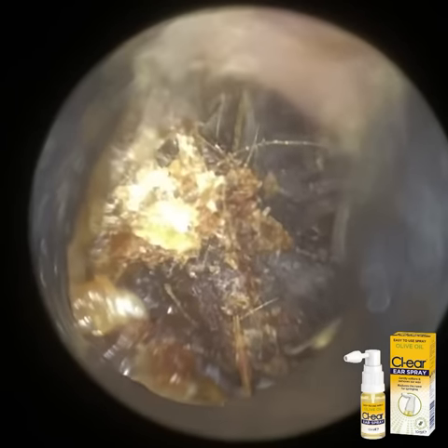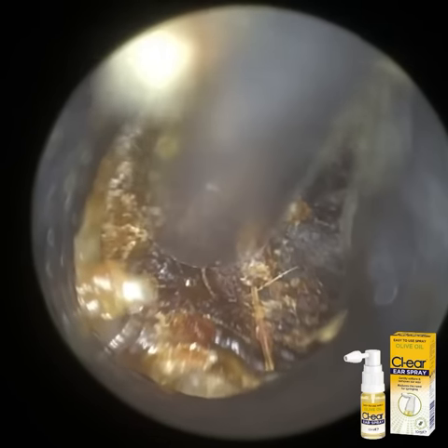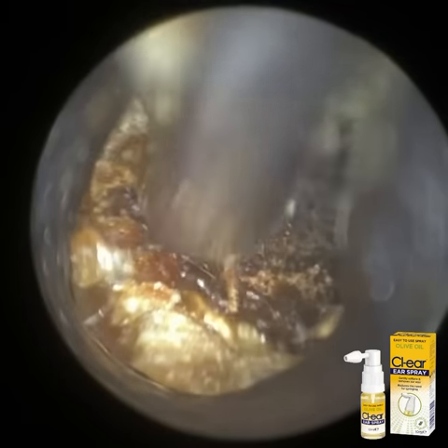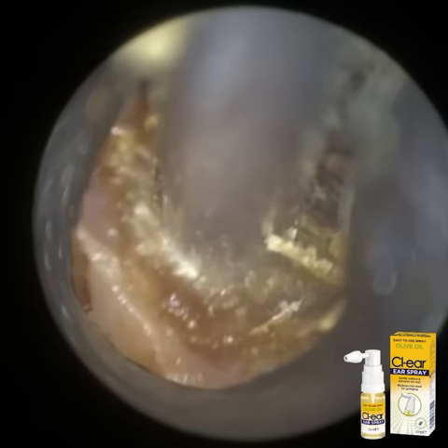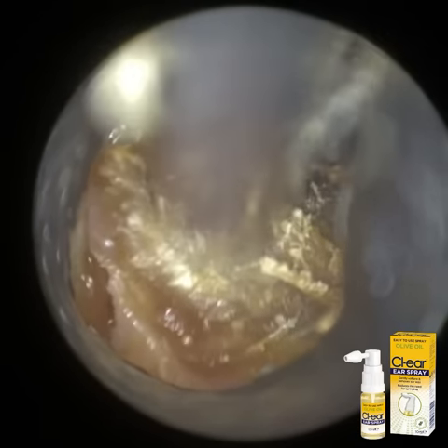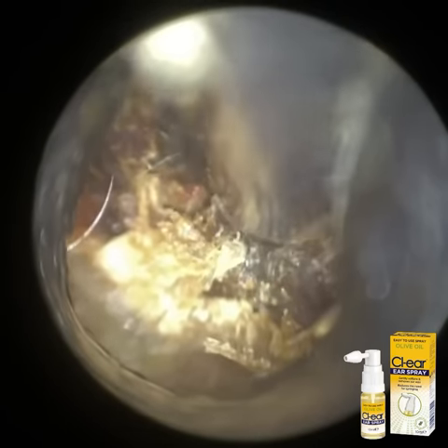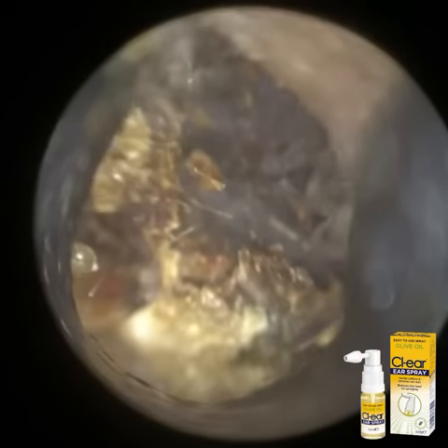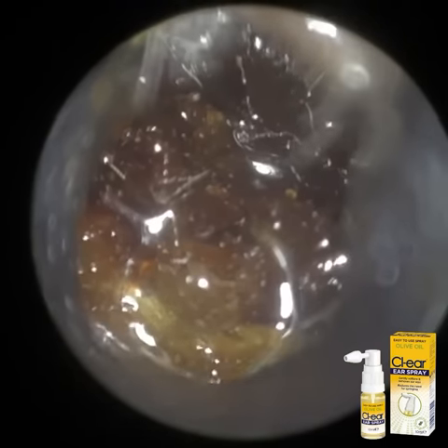In terms of patients using it, a lot of specialists, prior to you having your earwax removed, would advise you to use some olive oil spray or drops for up to 5, even 7 days, just to soften the wax, just to facilitate the procedure, make it a bit easier. With ourselves, you're more than welcome to attend without using any drops. We can use the drops ourselves during the procedure.